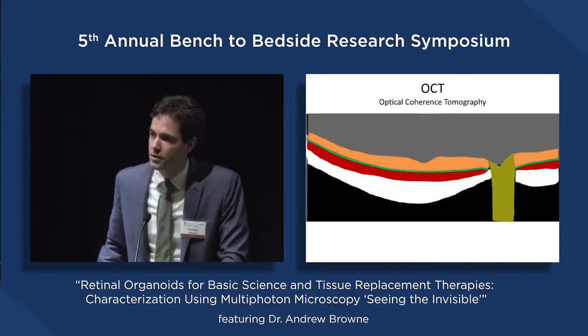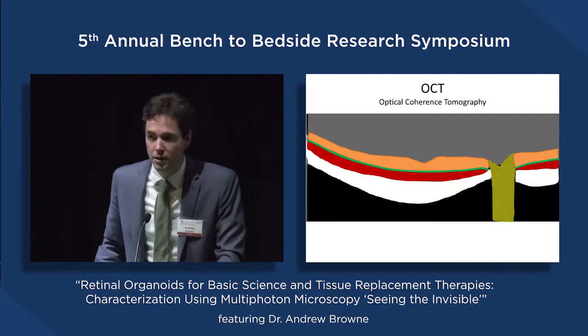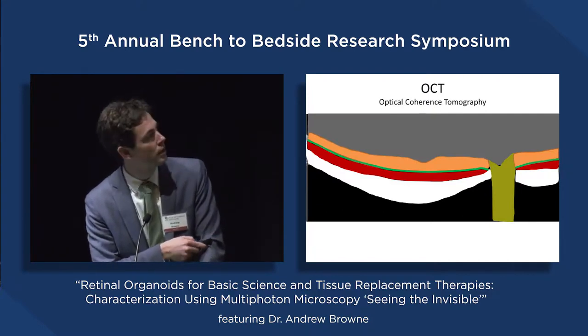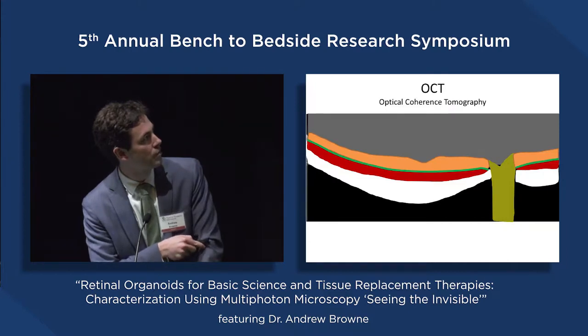And so we can zoom in a little bit further, and as you've seen some depictions today already in a number of talks, there are technologies that allow us to look at this resolution in patients on a routine basis. Pretty much every single patient that comes into one of the retina specialists' clinics here at Gavin Herbert has a photograph that looks like this. And so you can see incredible detail. That detail includes not only the optic nerve, which connects the eye back to the brain and sends all the information back to the brain, but also this foveal depression, which is completely normal. That's where light is turned into electricity, and we have the high acuity vision. Of course, the vitreous jelly inside the eye and the blood vessels underneath the retina over here as well.